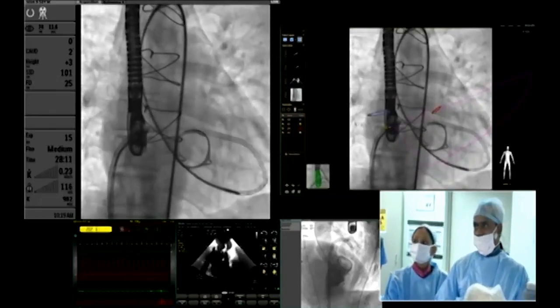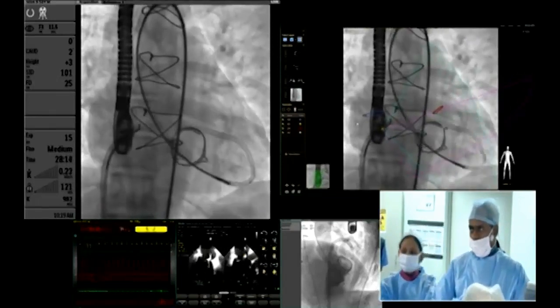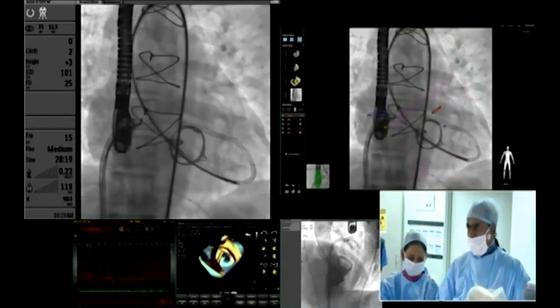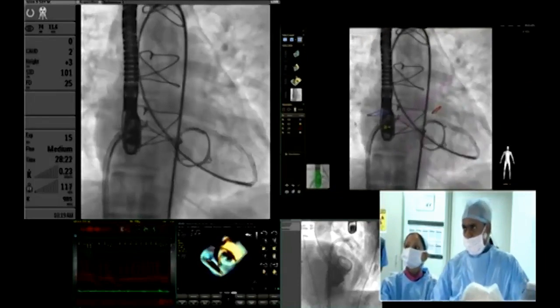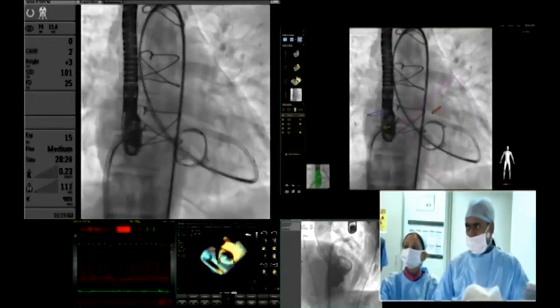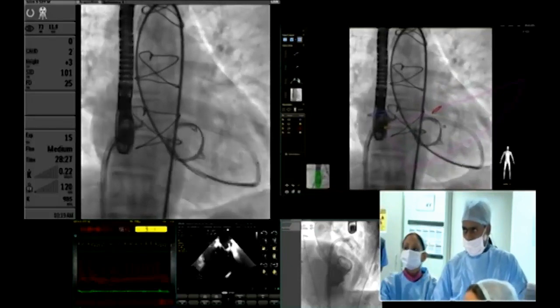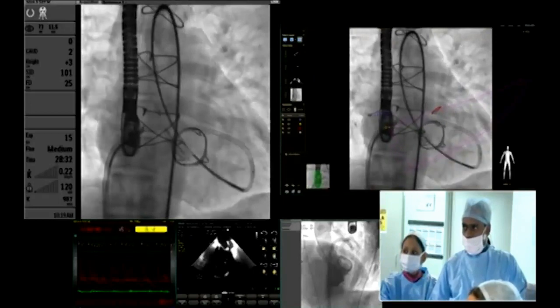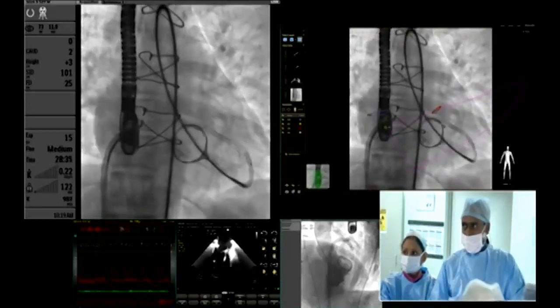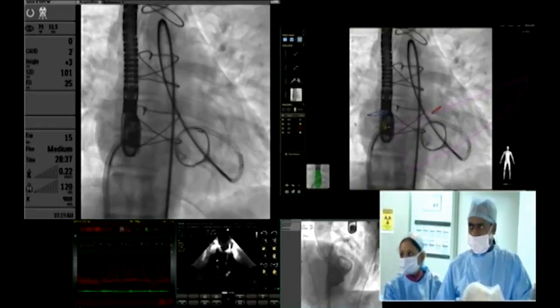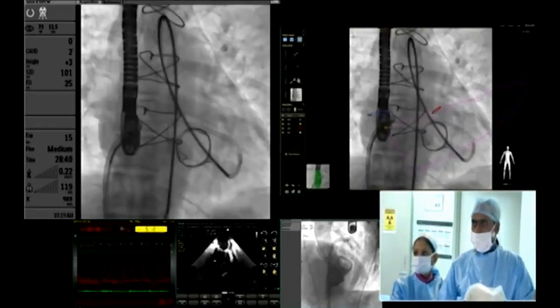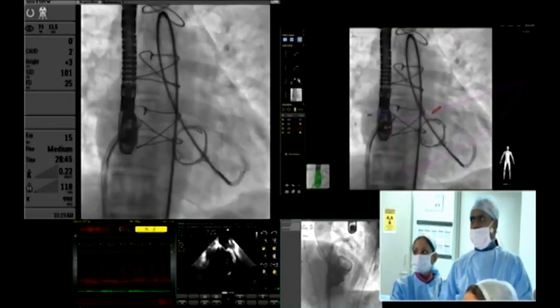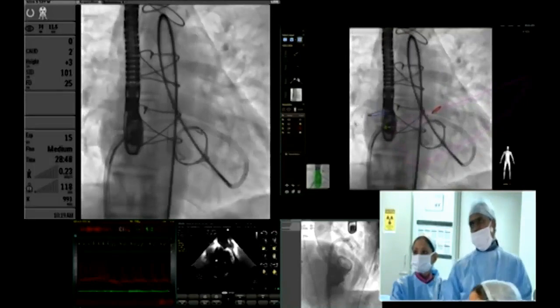The shuttle is kinking, so I am trying to get rid of the kink. I am now trying to advance the device — it is slowly making its way through. Sometimes it is better to keep a loop of the snare around the shuttle sheath in the LA, just in case it tries to slip back. I have already done that. Actually, that is behind the TEE probe — take out the TEE probe.